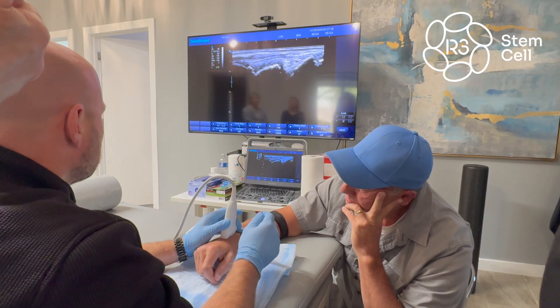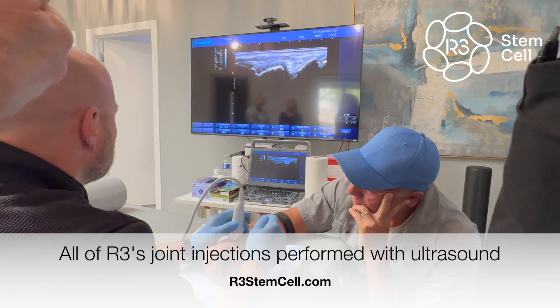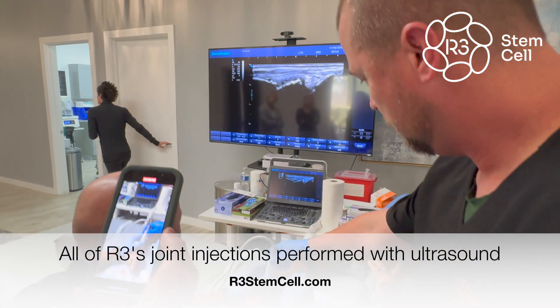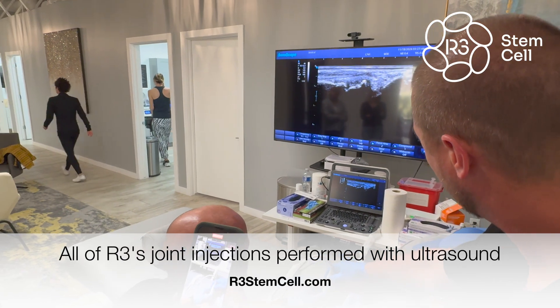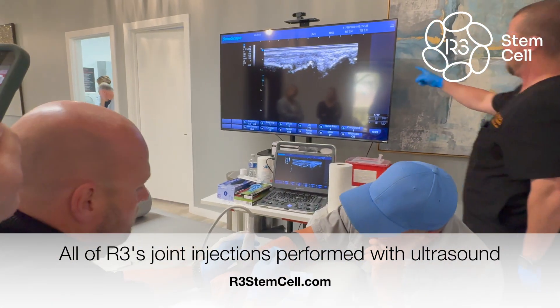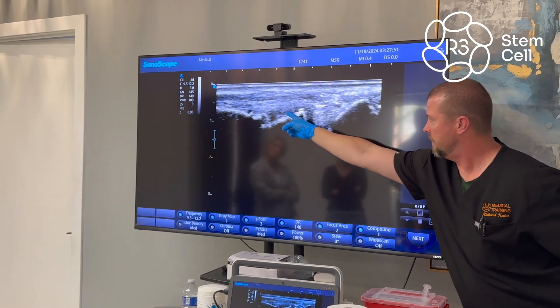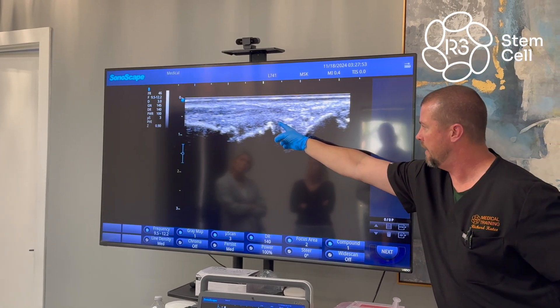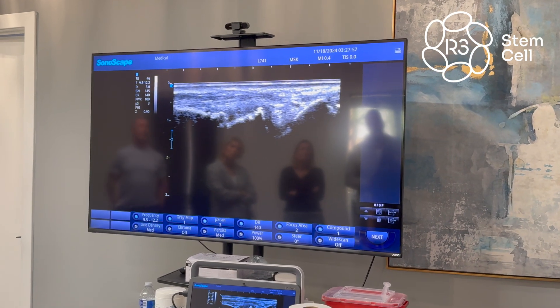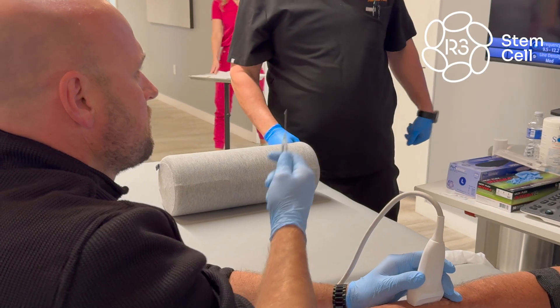It's going to work a little lateral and lower towards his thumb — I think that's going to be our best access point. Take the probe, go right over the top, come down this way, right over the top into here, come back and lay it right here. Do you have half a CC in each spot? Yeah, they're going to get a little stick.